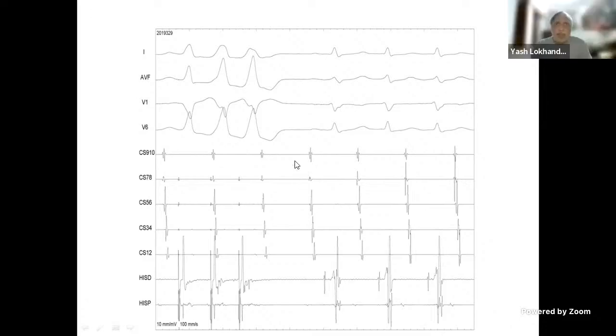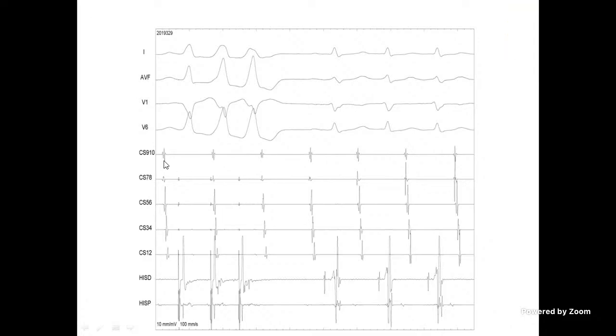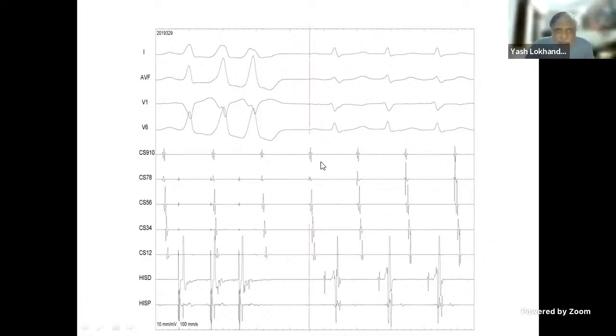Here you look at the atrial activation in any of the coronary sinus channels. You can look in CS 9-10 because there is no pacing spike, so you don't get confused. The pacing spike is seen in all the other intracardiac channels, but it is not seen in CS 9-10, so it becomes easy to look at. If you look at the atrial activation, it looks more or less regular. The atrial activation has continued almost uninterrupted by the PVCs. So if the atrial activation has continued uninterrupted, that means the PVCs have not done anything to it, and there's a short period of AV dissociation.